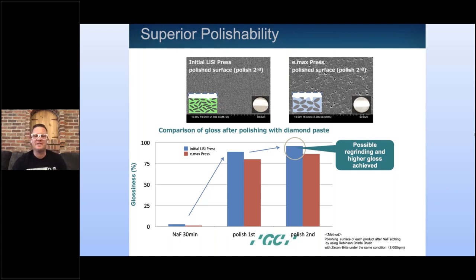Pretty much every day. Our rule at our lab is we cut back unless there's a reason not to, and then the doctors specify on the lab slip how much they want. Do they want a millimeter? We call it minimal, moderate, and maximum, usually a millimeter or 2 millimeters, or it can be more than that. So we can get as aggressive as we want, but I do it every day unless there's a reason not to, like there's no room to cut it back.